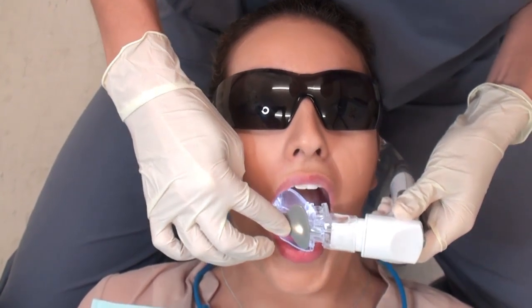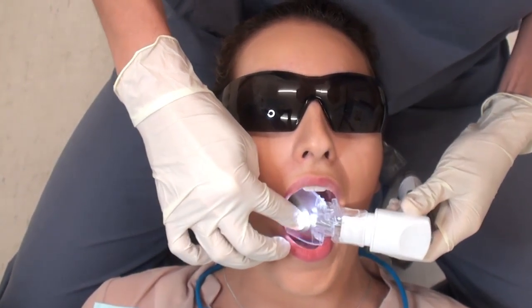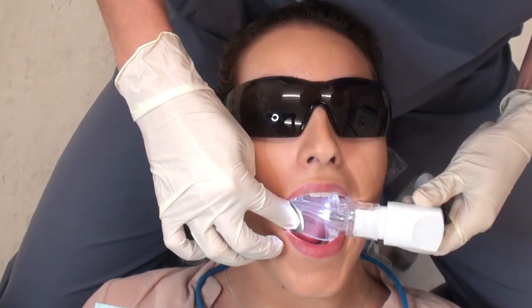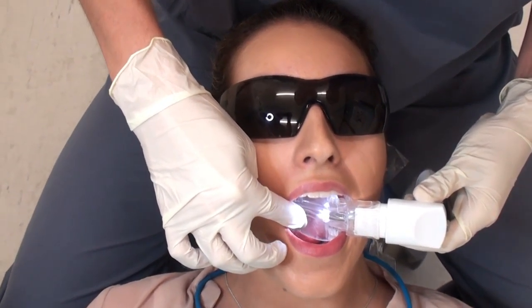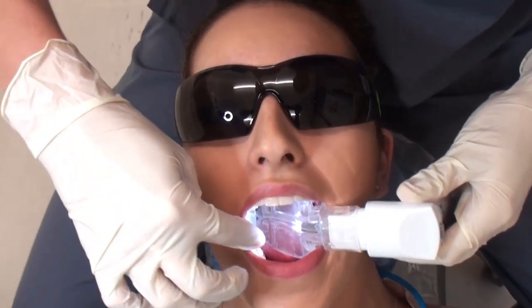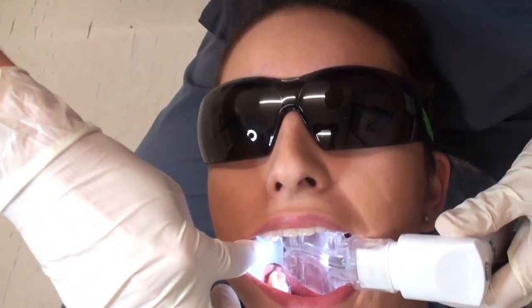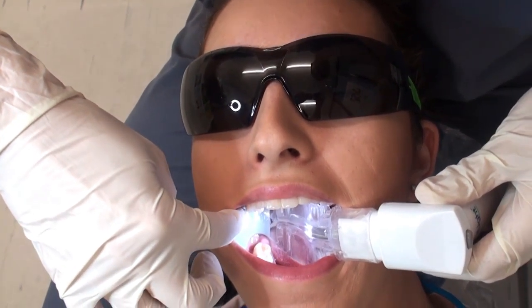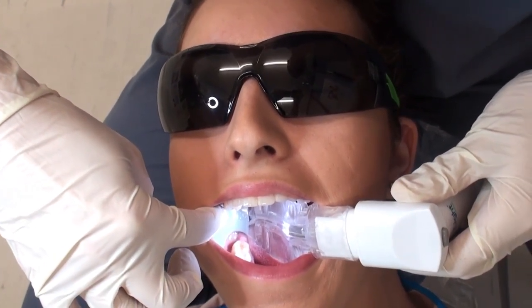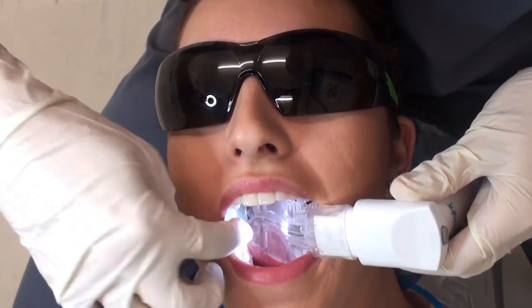Then place the mouthpiece into the patient's mouth, aligning the upper and lower teeth into the correct position to fit into the bite block section. Let go of the end of the mouthpiece and allow the mouthpiece to conform to the shape of the patient's mouth. If it gets caught in the teeth, gently manipulate it so it rotates behind the distal molar.